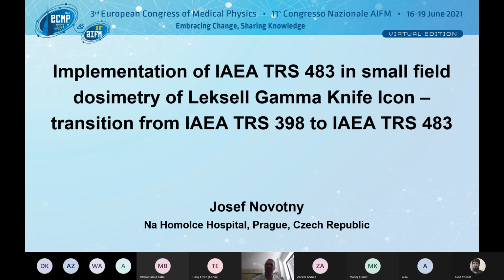Okay. So I am going to the last part. I have just a few slides, but I will be stopping a little bit in details. Hopefully we'll address it. This was actually sent as an abstract and then presented. You can see it, and I left the presentation as it was presented at the European Congress of Medical Physics, which happened last year in Italy.